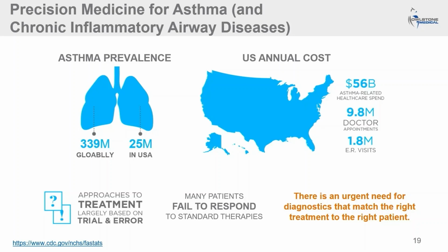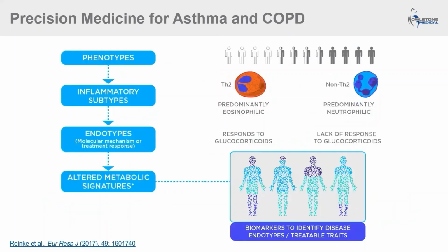Diagnosis and deployment of effective treatment options is a major challenge, despite an increase in the number of available therapies in recent years. This is due to a lack of stratifying diagnostics that could better inform to which treatments the patient will likely respond, mainly because it is very challenging to directly sample the biological activity occurring in the lungs without very invasive, complex, or stressful approaches. This has effectively resulted in a trial and error type of approach to better symptom management.